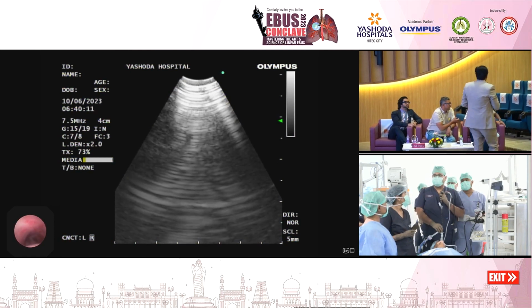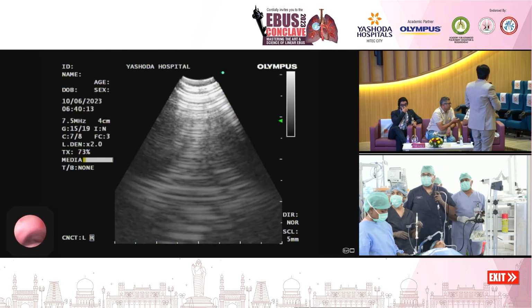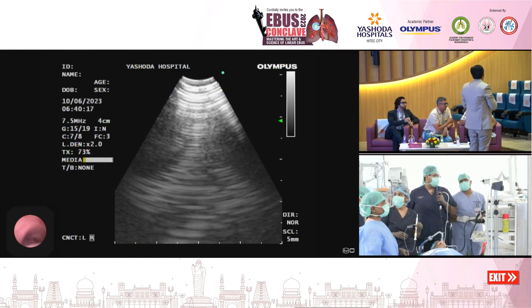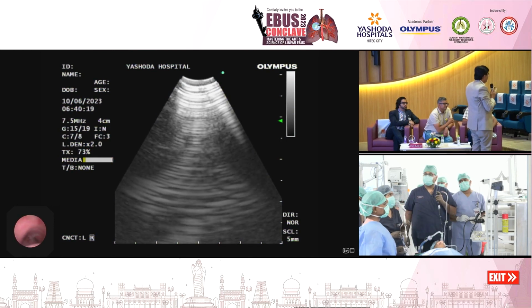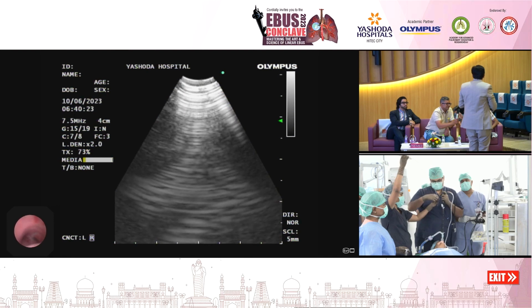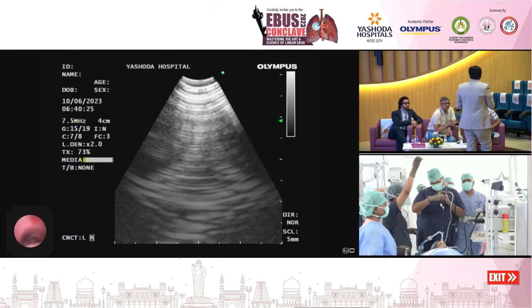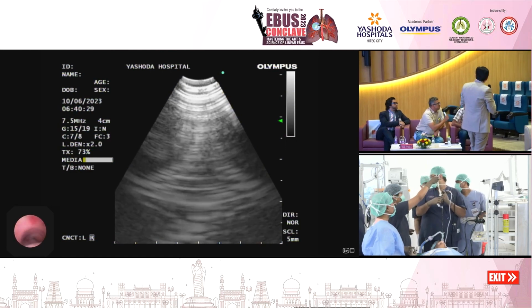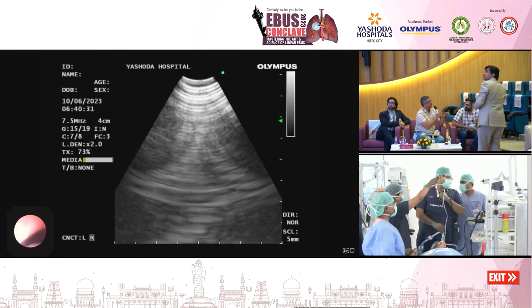2 or 3 N2 labeling them on an endosonography. So that is going more technical, but yes. So N2, I think it is always better to send the cell block separately rather than sampling multiple. N3 doesn't matter, N1 doesn't matter. But nevertheless, this multi-station disease at this point in time is quite an evolving area.